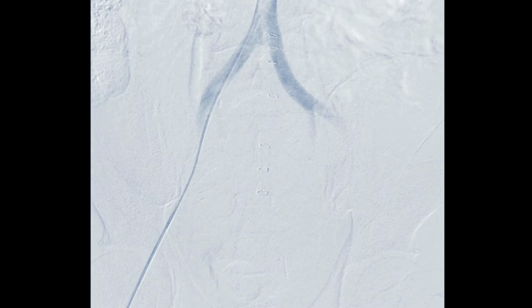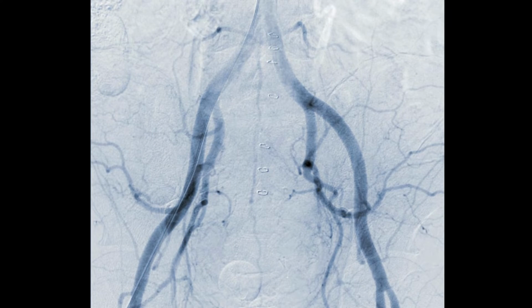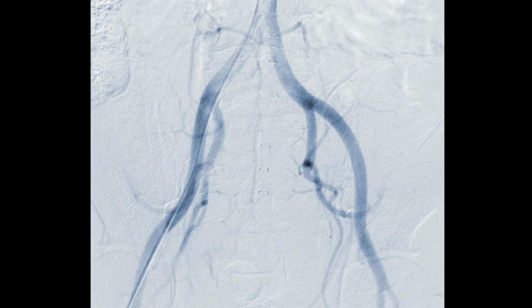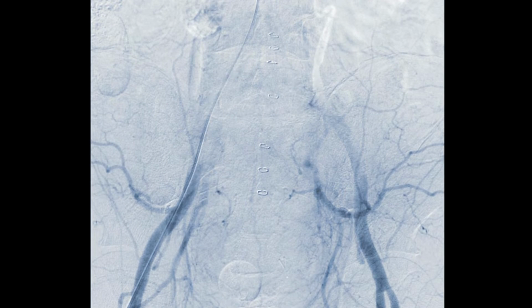Throughout the procedure, you will be monitored by surgeons and nursing staff, and they will communicate with you the steps of the procedure and adjust your sedation as necessary. The procedure itself usually takes about 1 to 2 hours. It requires you to be laying flat. After the contrast is injected in your leg arteries, your vascular surgeon will assess the images to locate any narrowing and plaque in the arteries that needs to be treated.